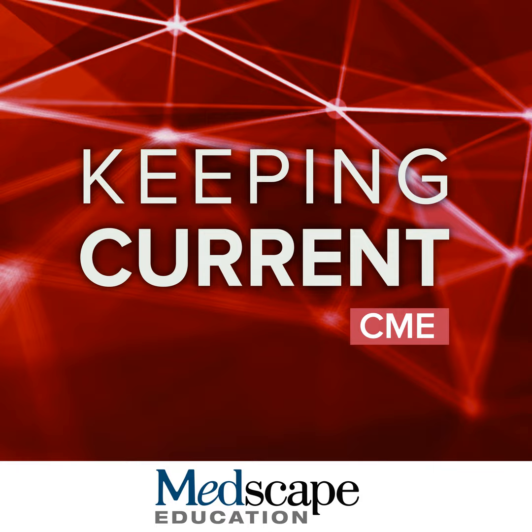This is just to show what happens if we acquire MRCP after gadoxetate. You can see T2 shortening and complete non-visualization of biliary tree. Importantly, how can we improve arterial phase? First of all, we do not use test bolus. We have to use bolus tracking. That would be the best.